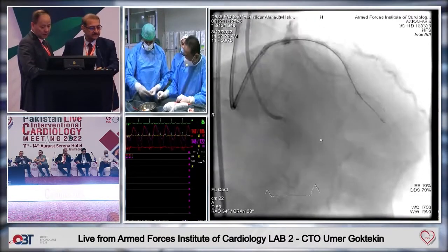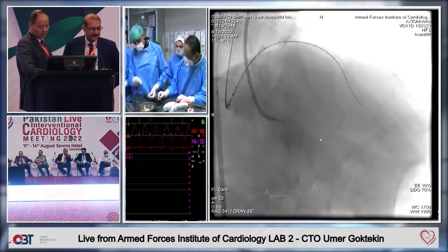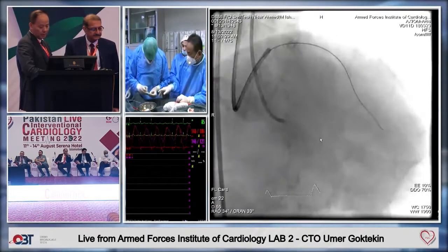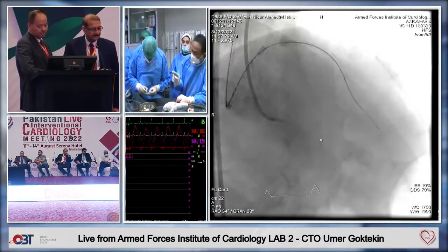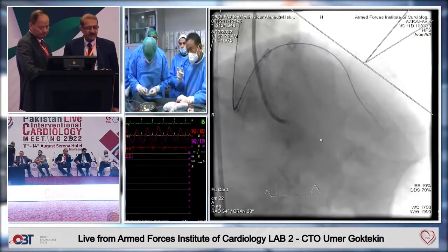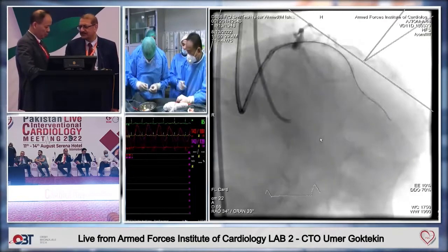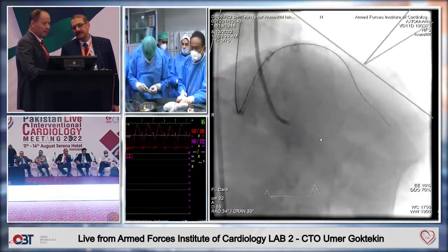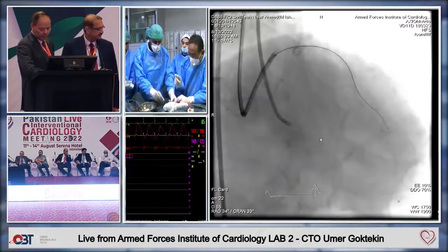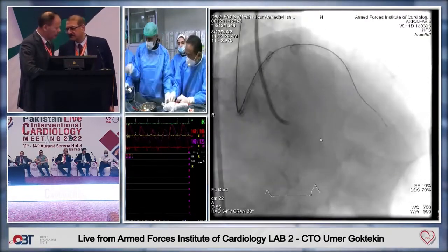But as said, the stump was too short. I think it's too soft. Even Gaia, you may have it, but Gaia has a fixed tip, and it's only at the tip where it's curved to about 28 degrees. So sometimes it doesn't catch the stump. So I believe in this case, a stiffer wire, where you can control the curve and which is also more steerable, would be a better choice. Okay, trapping.